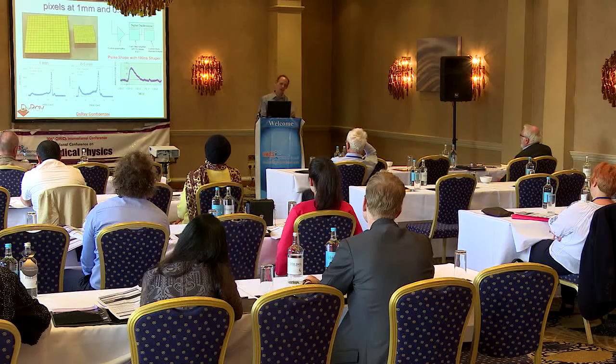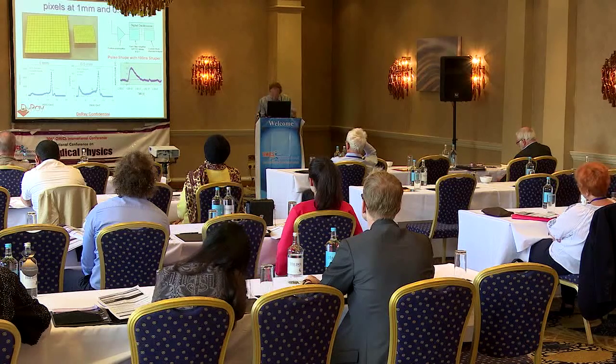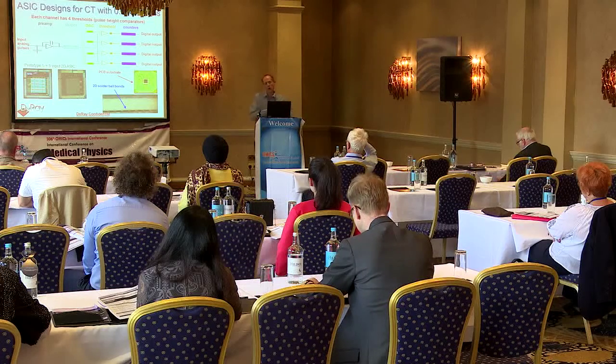Here also we show cobalt spectra. And so also it's important to move beyond dual energy methods. So dual KVP CT is becoming more and more popular. It's because it can increase material specific contrast, and it can also reduce the dose by optimal energy weighting of the different energy images. Although 2 is good, 4 is better.